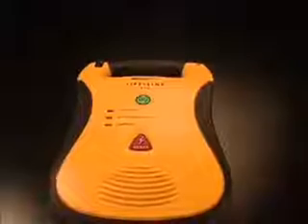Performing battery pack self-test. Battery pack OK. Remove the battery pack by pressing the battery eject button until the battery pack is partially ejected; it may then be completely removed by pulling it out. Always store the AED with the battery pack installed.